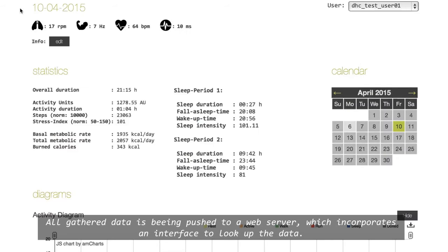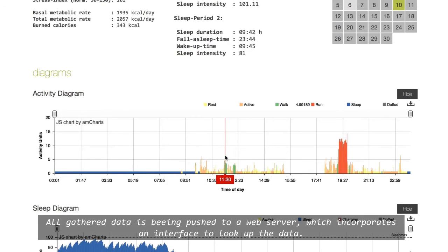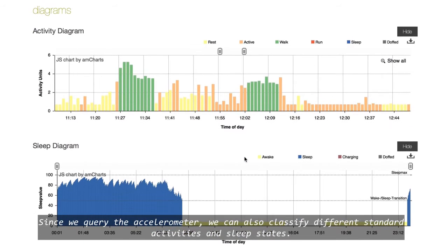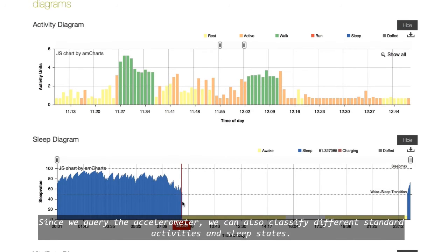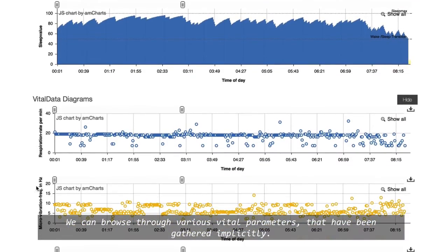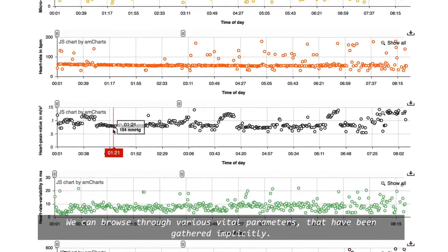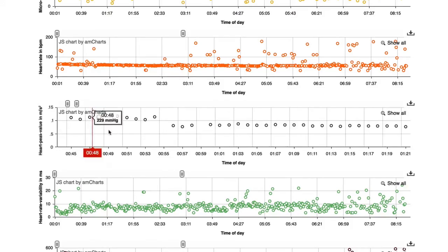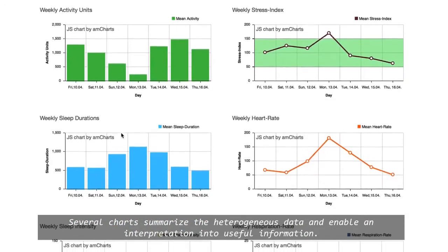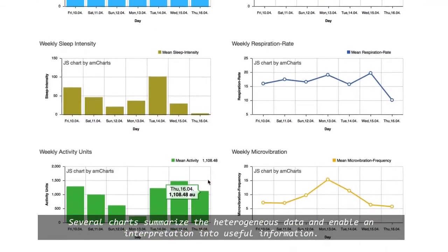All gathered data is pushed to a web server which incorporates an interface to look up the data. Since we query the accelerometer, we can also classify different standard activities and sleep states. We can browse through various vital parameters that have been gathered implicitly. Several charts summarize the heterogeneous data and enable interpretation into useful information.